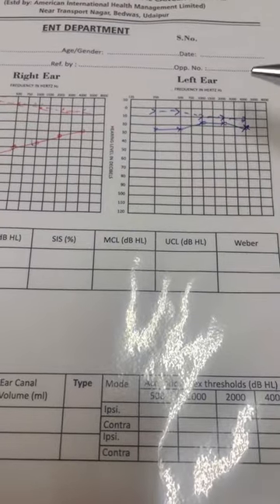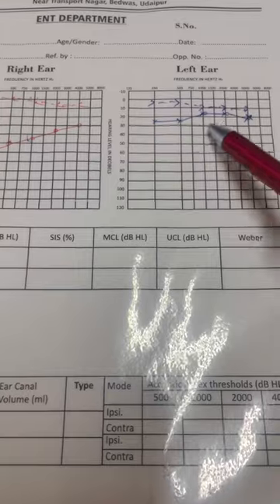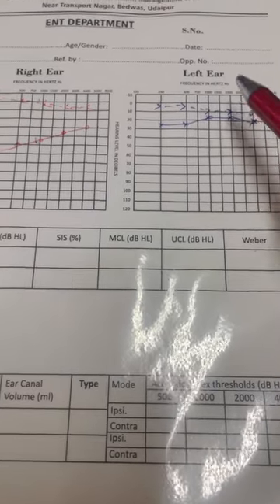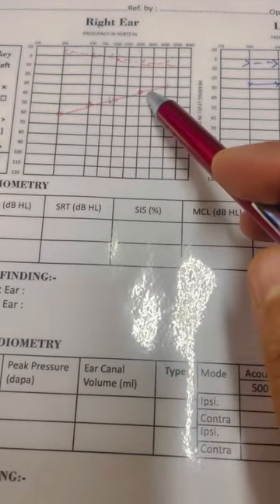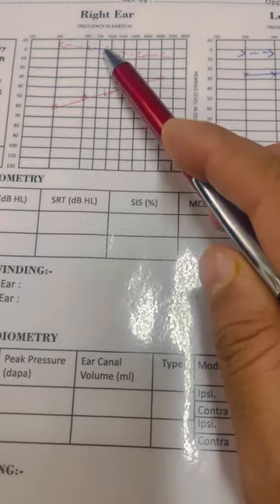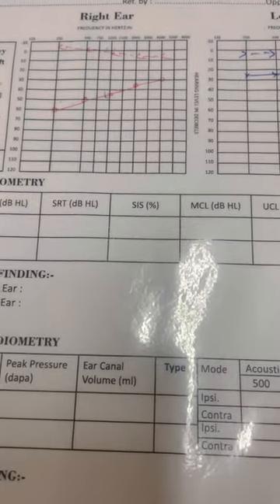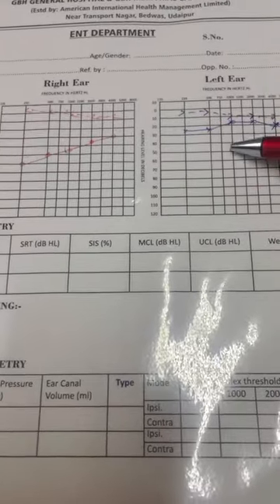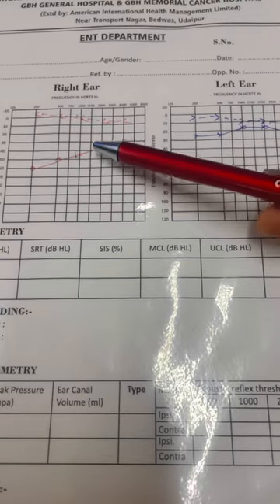This is another common audiogram seen in our OPDs where one ear is showing absolutely normal air conduction and bone conduction, whereas the other ear is showing a dip in air conduction but normal bone conduction, with a large air-bone gap. This is classical of conductive hearing loss.